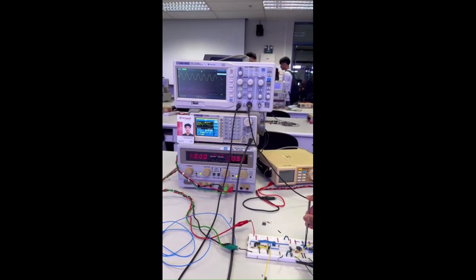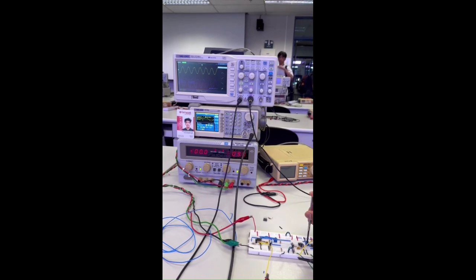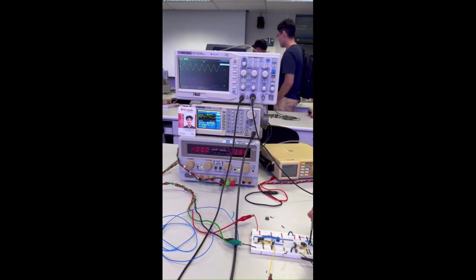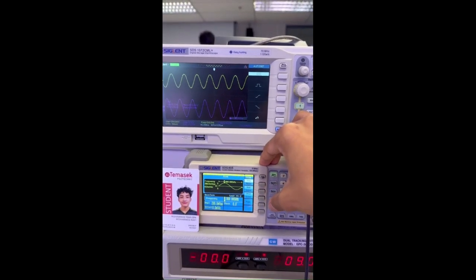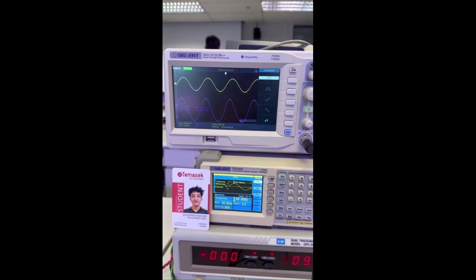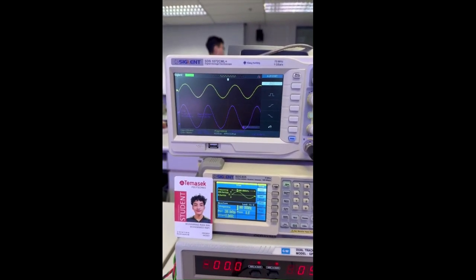And as I adjusted the trimmer potentiometer, the voltage changed to 6.4 volts. So we know that it is directly responsible for adjusting the output volume of the whole circuit. This is me changing the frequency to 1 kHz. Now the V peak to peak is 1.86 volts.